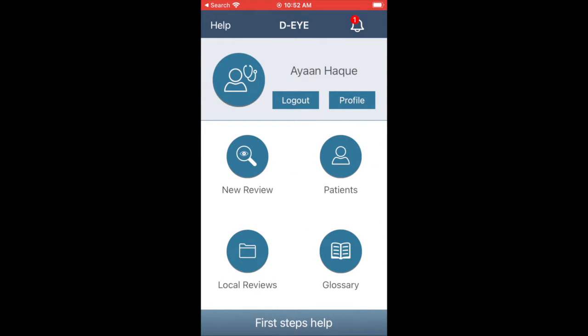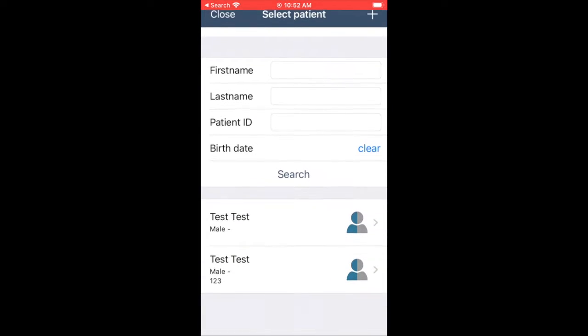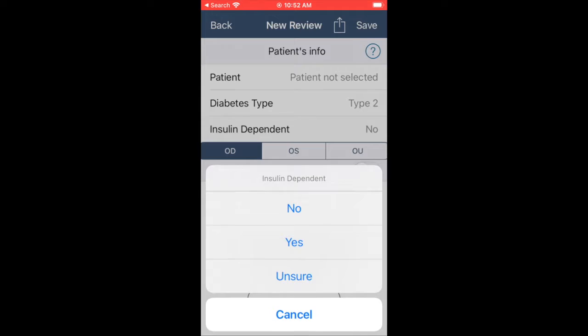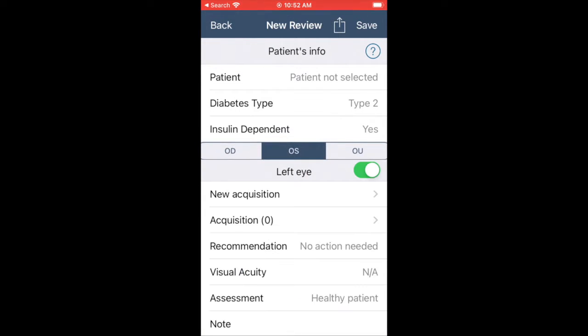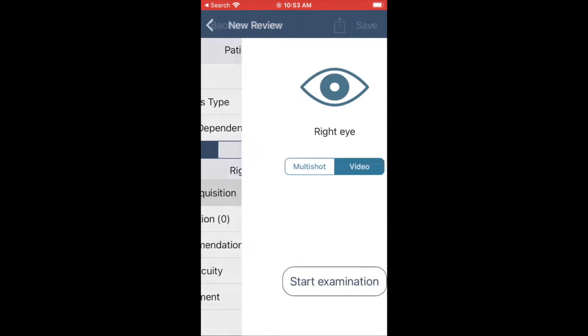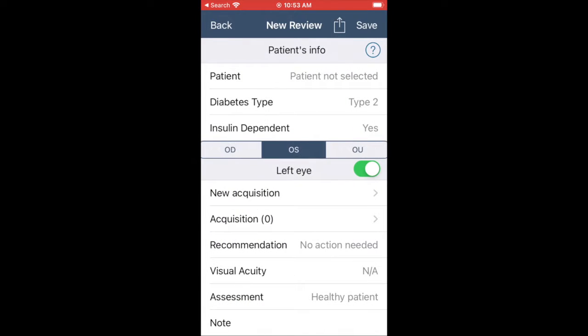Once we're logged in, we're going to click New Review, and this is going to allow us to get new image acquisitions. So you can enter your patient information, and you can choose the diabetes type and whether or not they're insulin dependent, which will be good to track their health records. We can obviously take images with both right and left eyes. Here's how you would switch. You press OD or OS. And then to take a photo or video, you would press New Acquisition.